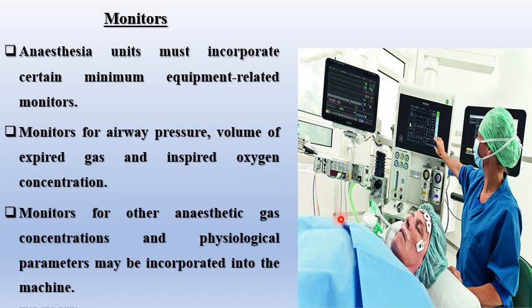Monitors to measure patient physiological status like state of awareness, capnography, pulse oximetry, blood pressure measurements, either invasive or non-invasive, and ECG. It is connected also to the machine. And the mechanical ventilator, as a safety, measures how much is the inspired concentration of oxygen, carbon dioxide, gases, expired concentration. Also for the action and function of the ventilator like pressure and volumes.